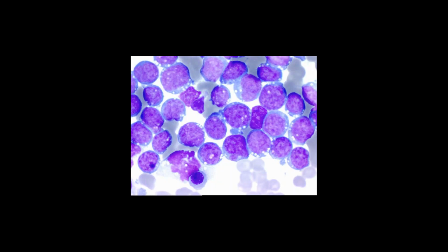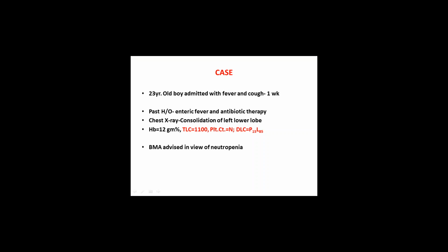This is a very classical picture of lymphoid cells showing a lot of vacuolation. Most of you must have guessed it. It's an L3 type of blast.